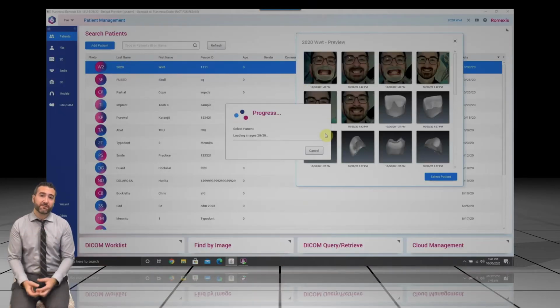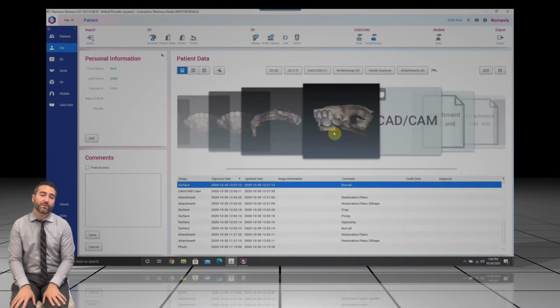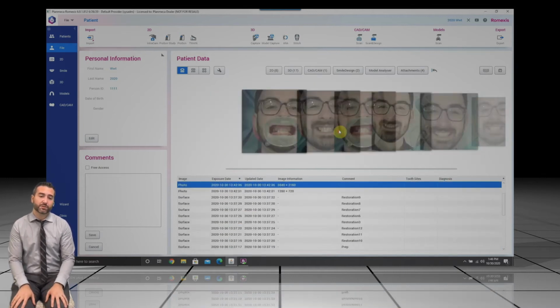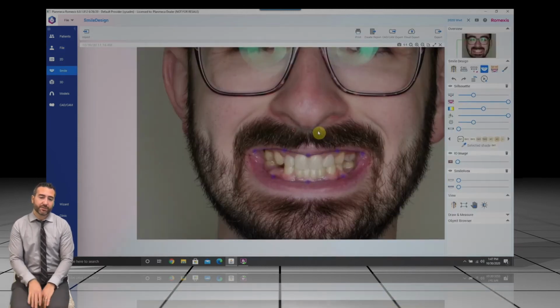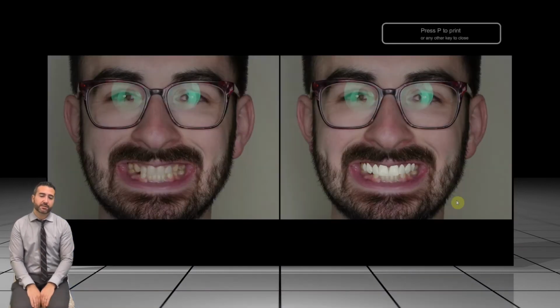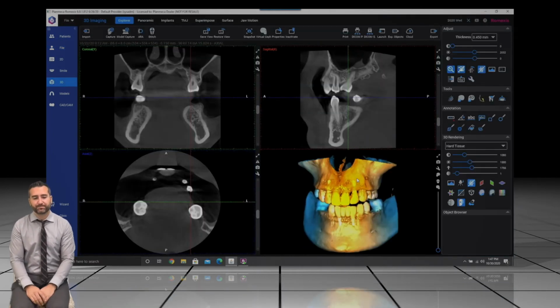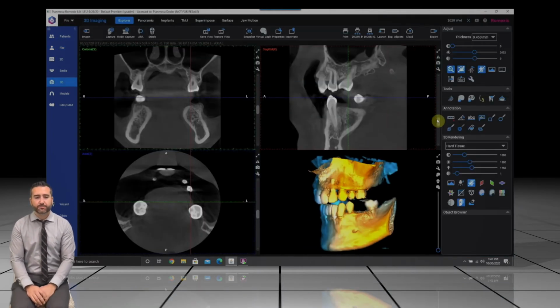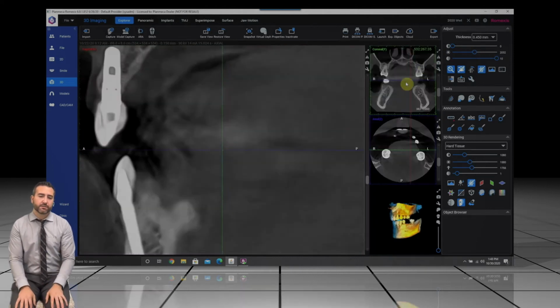so much excitement from the patient when they see their CBCT, and I always sit down with my patient. And actually this is what we're doing here. The patient's sitting down with me, and I'm going through their images. I'm showing them really quick their smile design, and then I'm going to bounce really quick to their 3D image. And now we're going to go ahead and plan these implants.